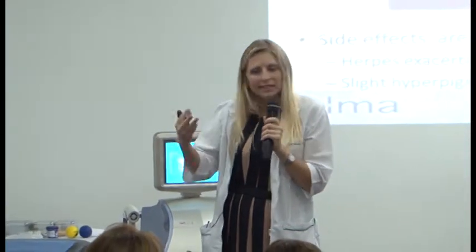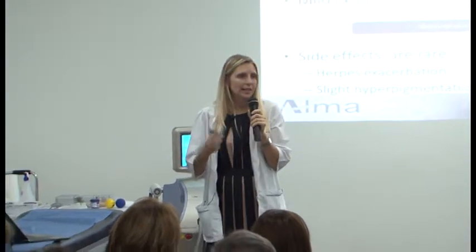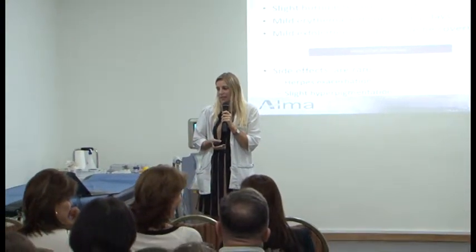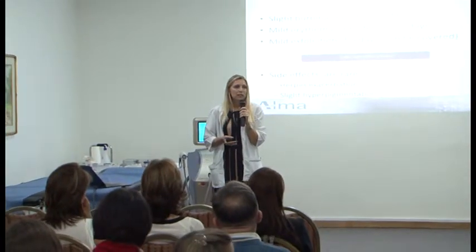Regarding some after procedure considerations, a slight burning sensation occurs right after the procedure, and it usually lasts for about 12 hours. Mild erythema and edema last for about a day or two. This is the only actual real downtime, because the edema is very hard to cover with makeup. But if you do it over the weekend, usually by Sunday, Monday, the erythema and the edema vanish, and then what appears is mild exfoliation, which lasts for about 3 to 5 days.